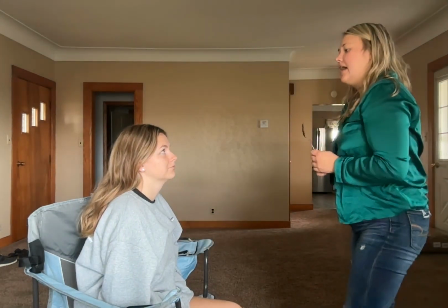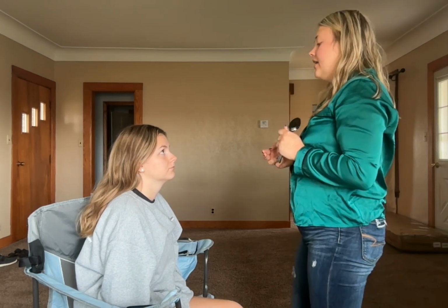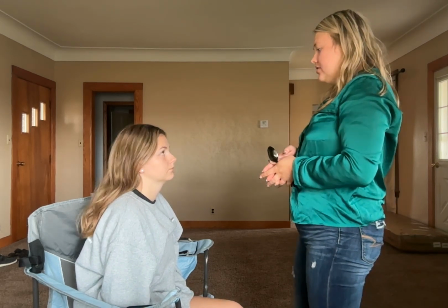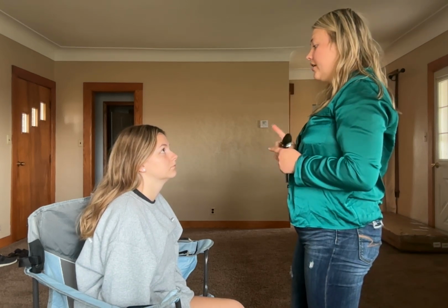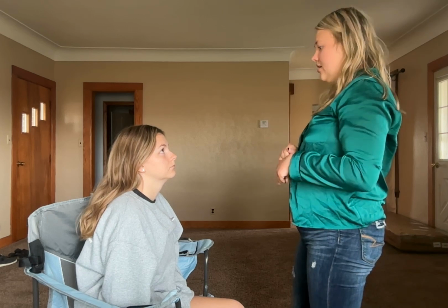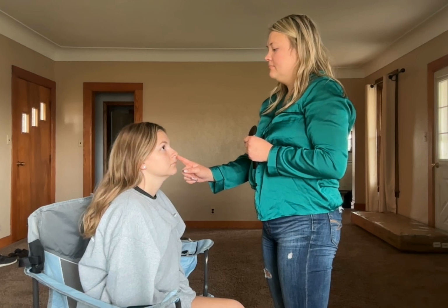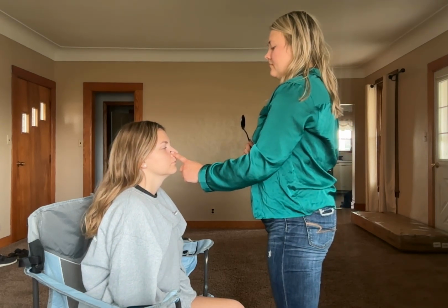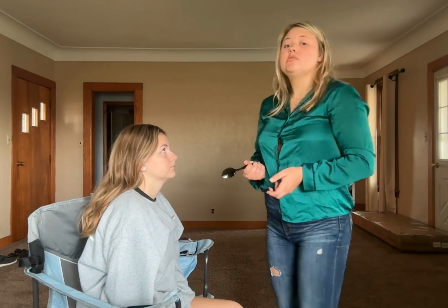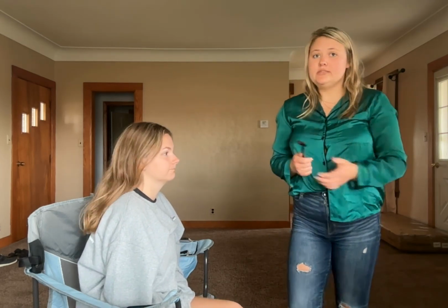So next I'm going to take my otoscope and I'm going to assess the patency of your nasal nostrils, and I'm going to look inside of your nose. So first I'm gonna test the patency. I'm gonna do each nasal ridge one at a time and see if there's any obstruction. So I'm gonna close this side and have you breathe in. Good, and then I'm gonna have you do it again on this side. No obstruction is noted. There was also no reported, and there is no suspected nasal injuries.